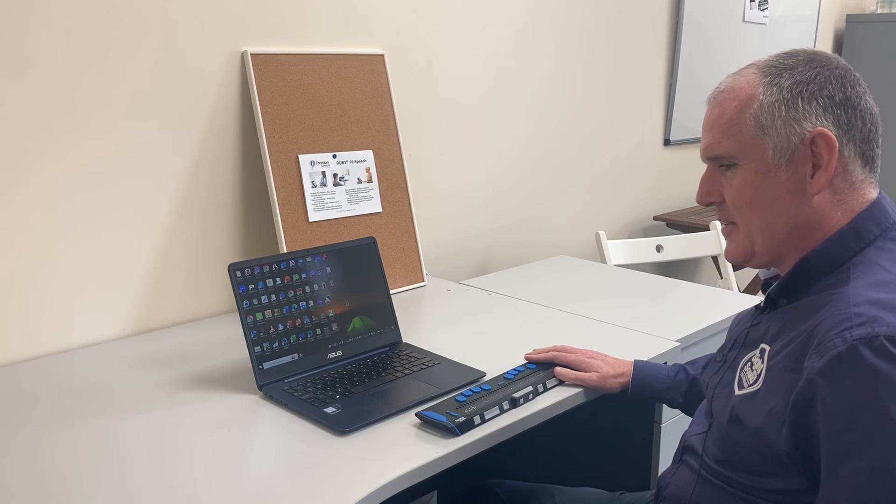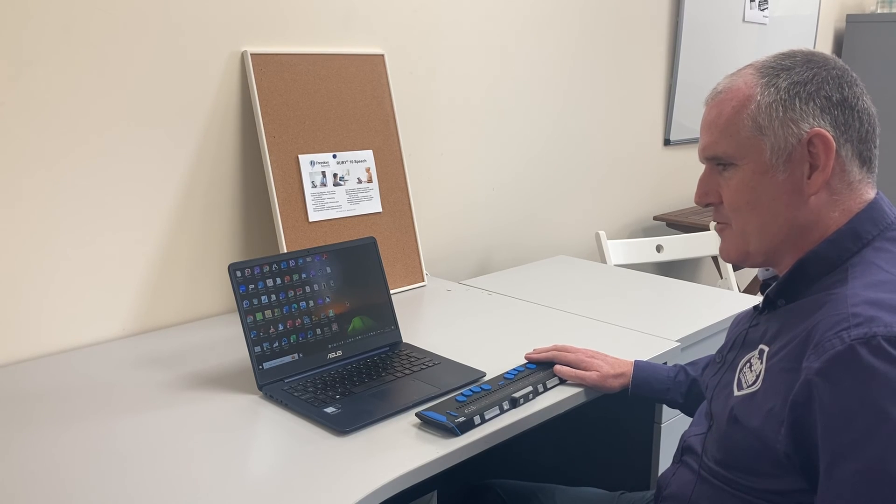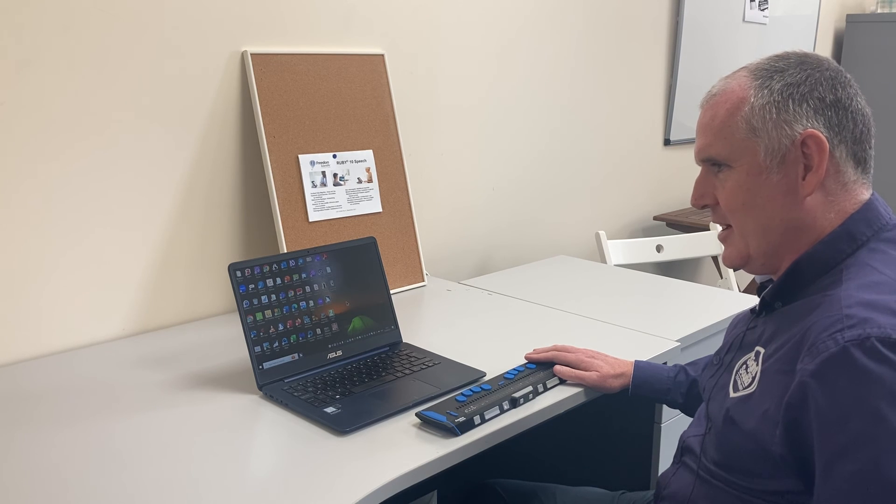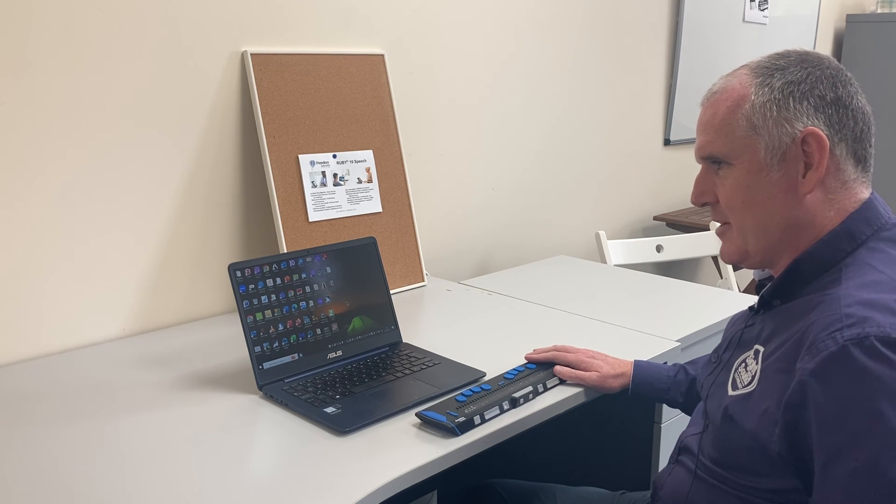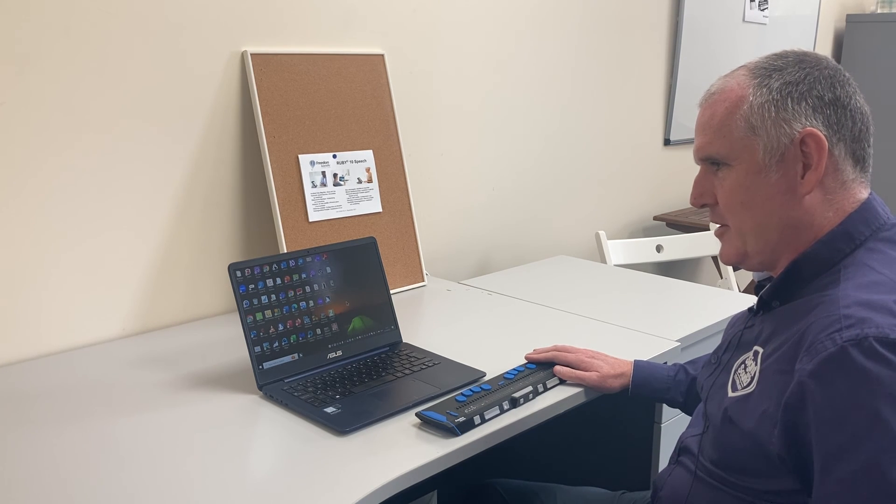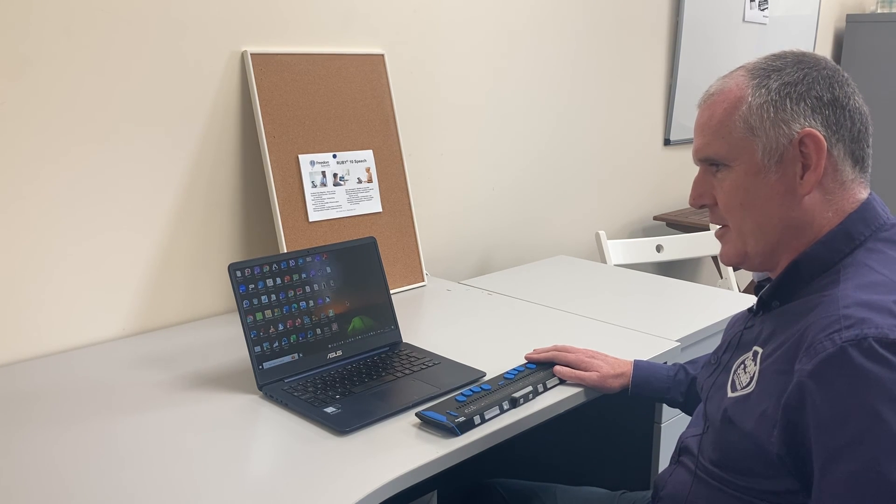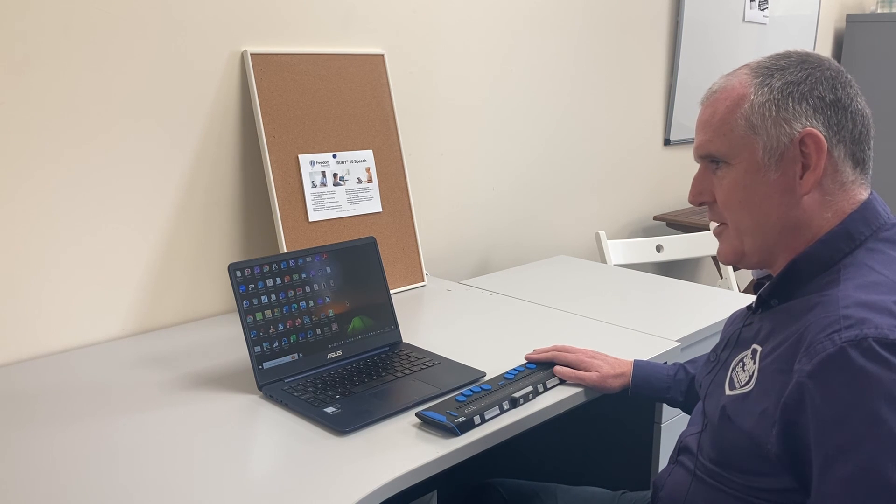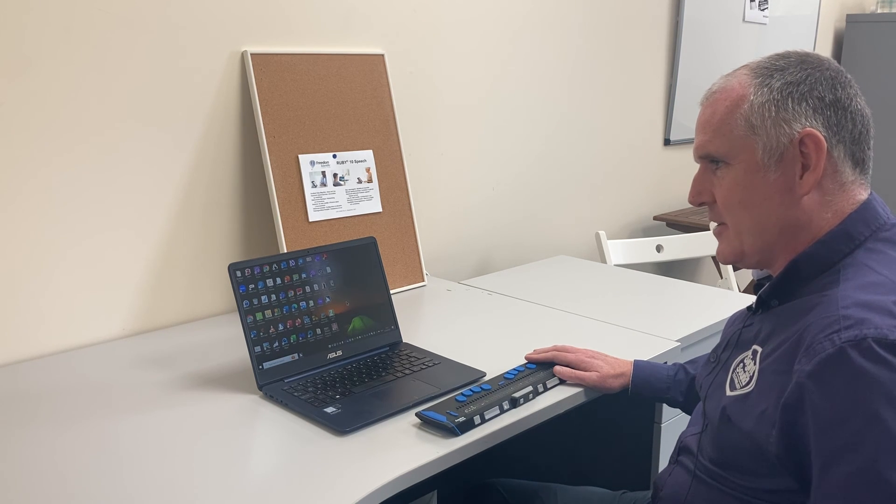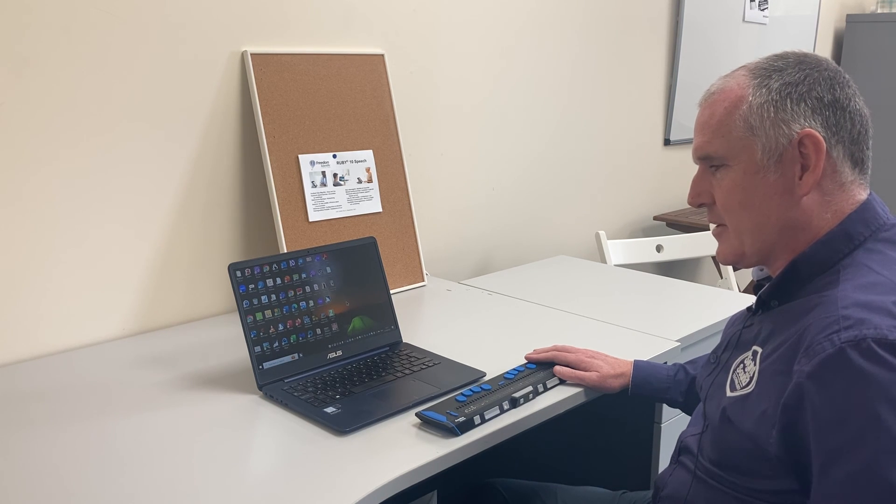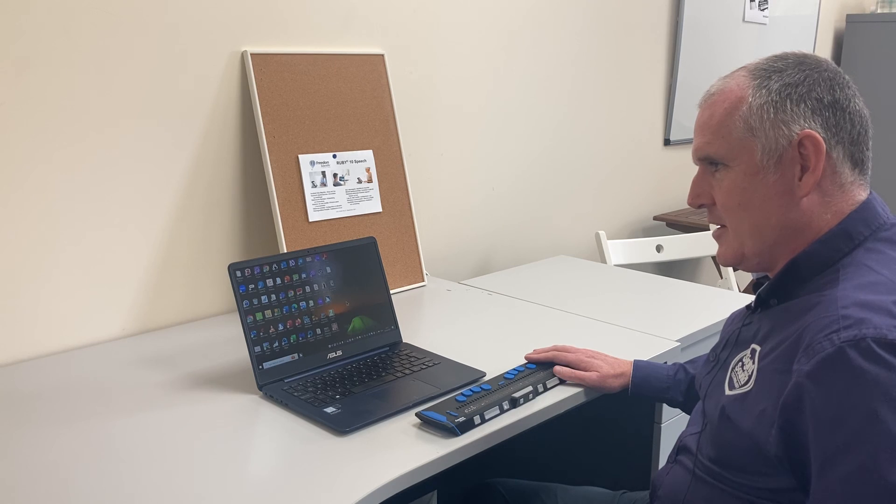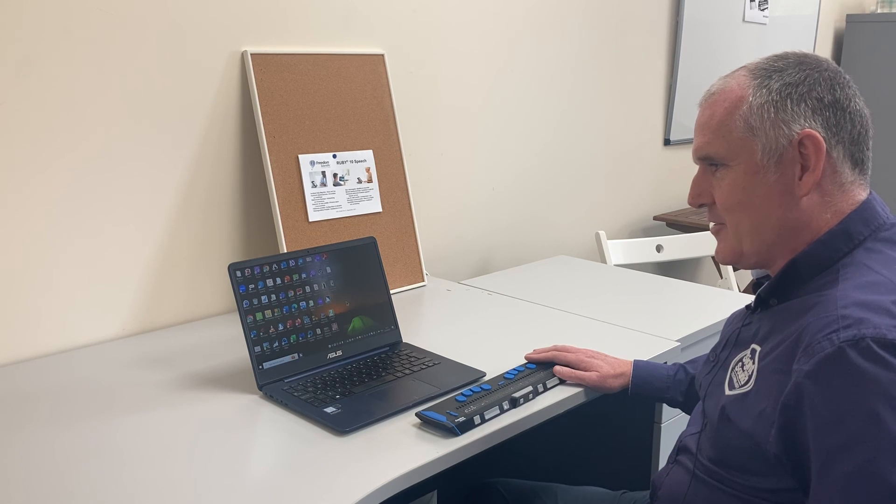As you can see, this is a really powerful combination of technology and can be particularly useful when you're in work or in education. If you'd like to find out more about how this technology works or receive training, please get in touch with us.